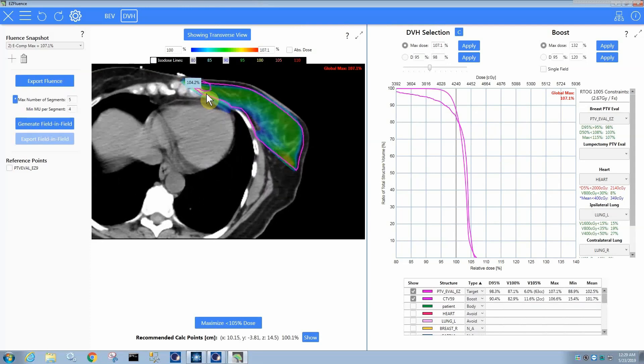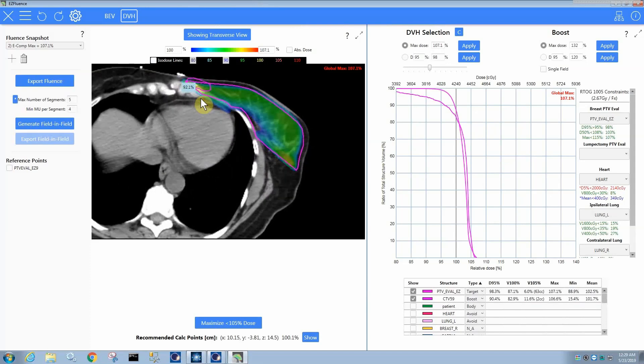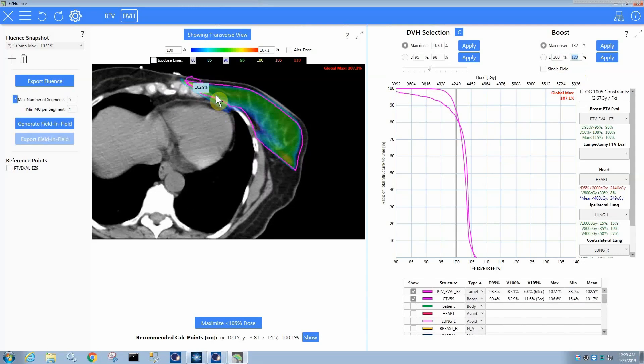So something to be careful of is that your structure is reasonable in terms of what you can cover. Obviously, it's okay to have a structure that you can't fully cover as long as you understand that if you were to type in full coverage here, D100% being like 100%, then you're going to blow up your plan.